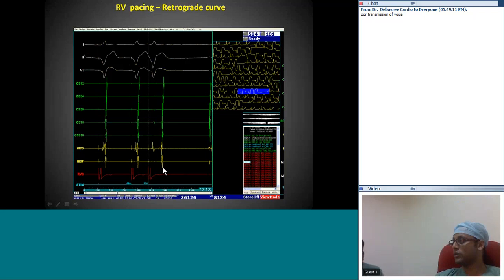The earlier the stimulus which it gets, it starts delaying a bit more. That is a protective mechanism. If we didn't have it, all the atrial flutter and fibrillation would be conducted 1:1. So there is a decremental conduction. As I am giving more extra stimuli, it separates. So that is delayed in the AV node, but it is still a midline conduction. So it is a normal conduction.